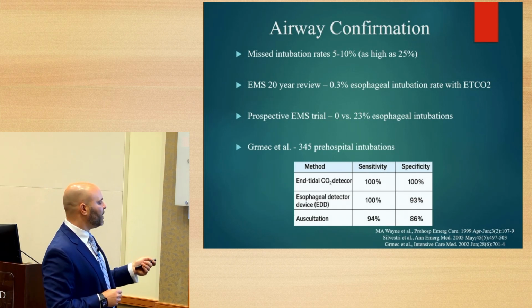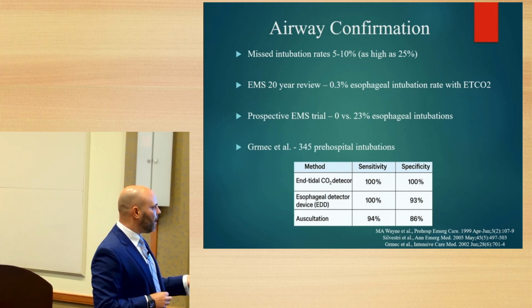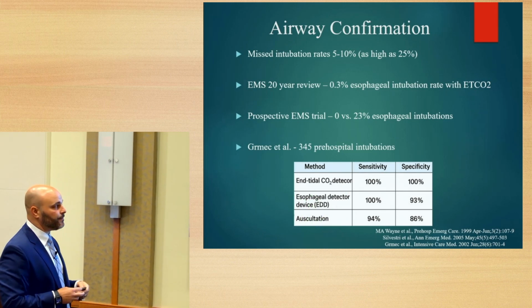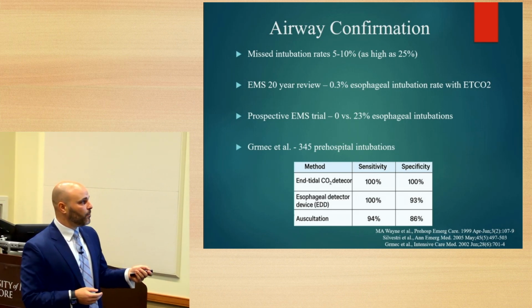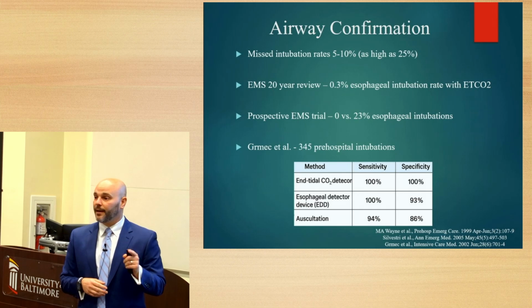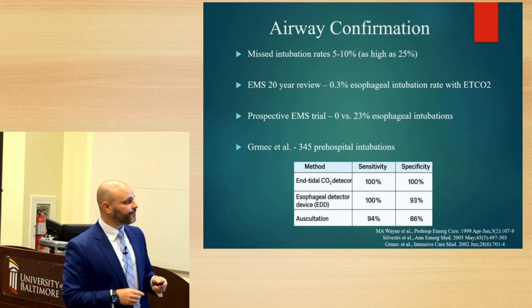And then Gurmek used a nice pre-hospitalization intubations review comparing CO2 detector, esophageal detector, and auscultation. And all did okay, but end-tidal did the best with sensitivity and specificity of 100% and 100% positive and negative predictive value.